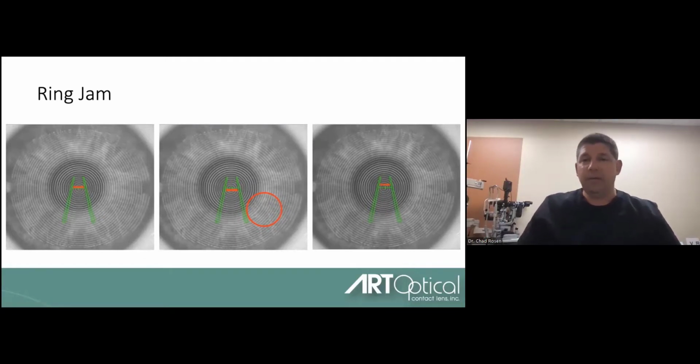If they're not looking really good, things you can do, I like to use a non-preserved, very low viscosity artificial tear. You don't want to put anything too viscous in because sometimes that can cause some artifacts as well. It may take too long to clear, but put a drop of low viscosity artificial tear in, have the patient blink a few times and see if that clears it. Sometimes just blinking alone clears it, so you can kind of see fluctuation as they blink. But you want to make sure when you go to save the image, you're saving one that's got the best rings possible.